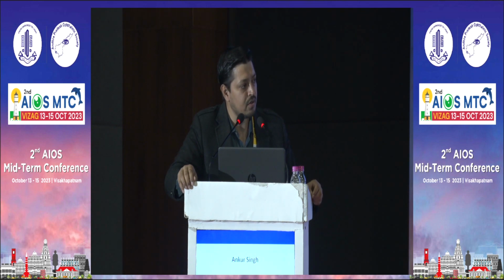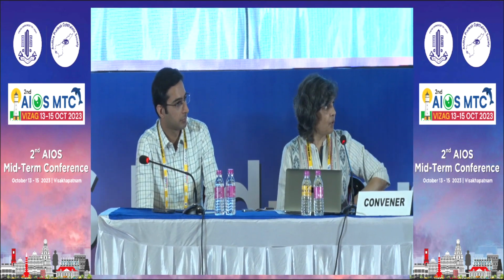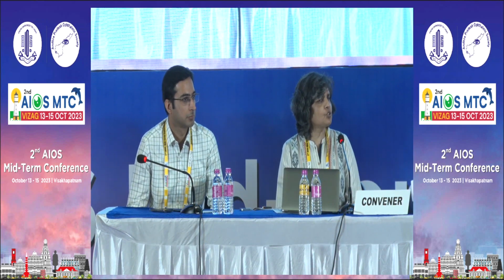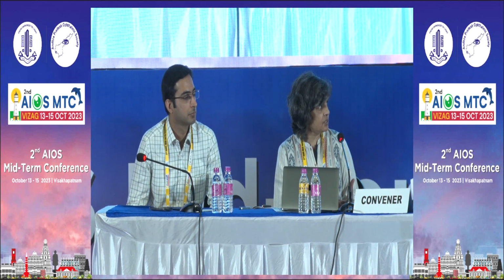Malika, do you do OCTA in all CNVMs? No. Initially we used to, but we found that it has no correlation with activity or treatment. So not every visit, not at all. But more importantly, we use it to confirm the presence of NVD or NVE. If we suspect there is a fine NVD, not sure, then OCTA can really show up the new vessels on the disc to add the laser.